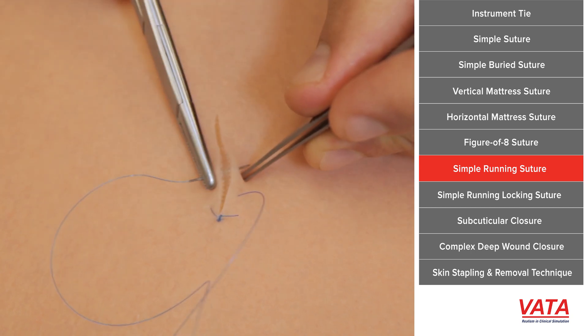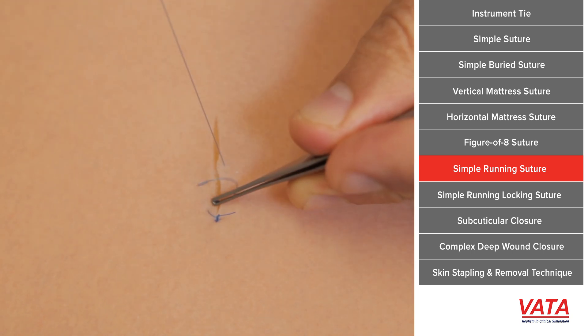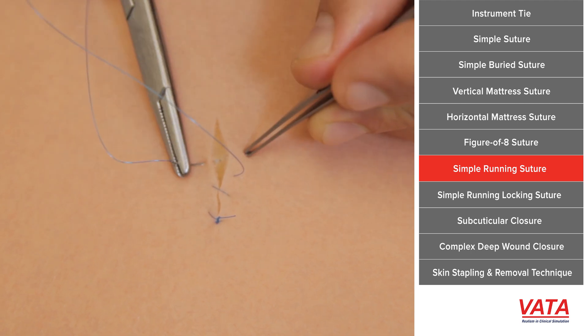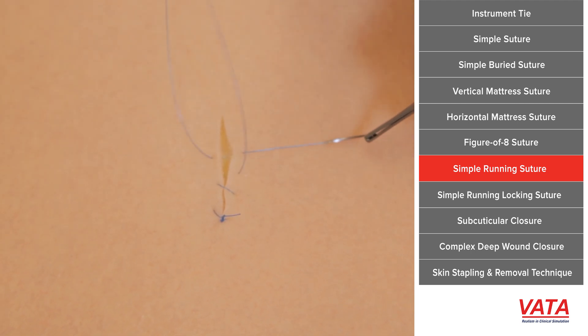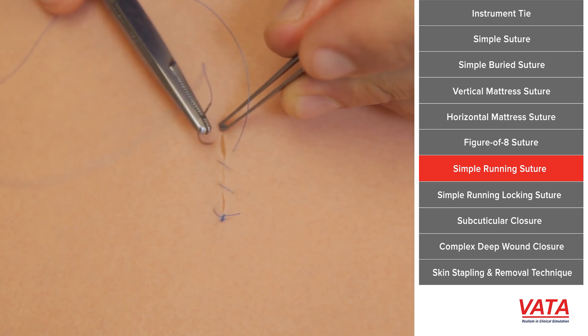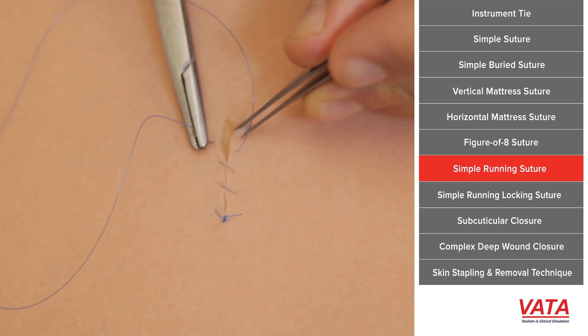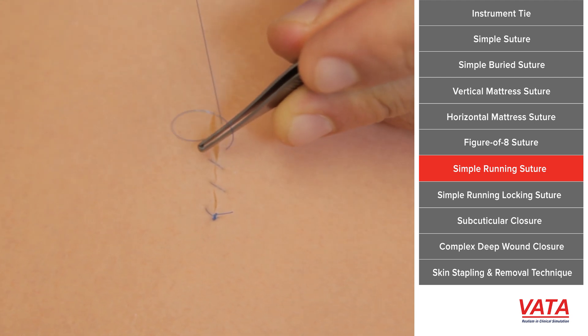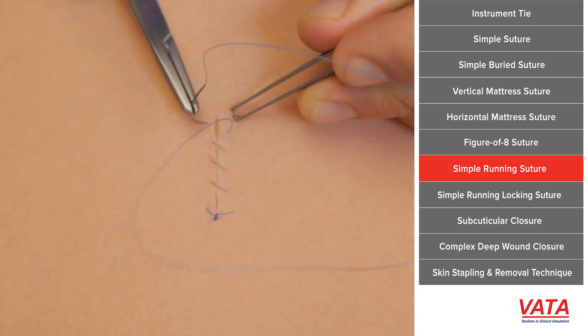Move along the same distance, a few millimeters, and take the same distant bite on each side. As you start to get better and better, you can just go faster and faster. What's going to look nice is that you've done it exactly the same way each time. Now because we're going straight across underneath the skin, outside we're going to see a slanted suture like a baseball — we sometimes call this a baseball stitch.